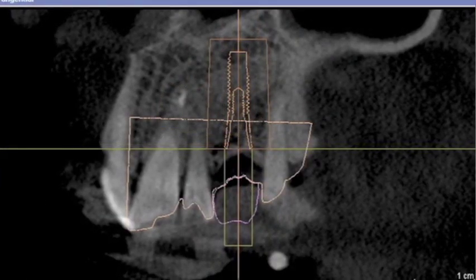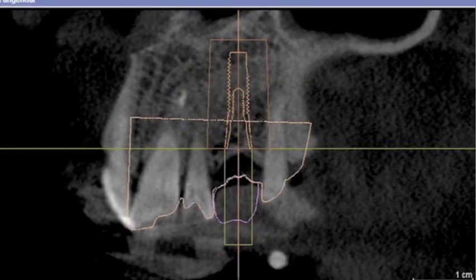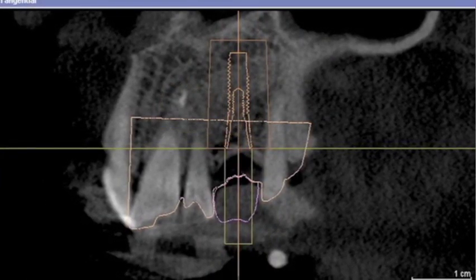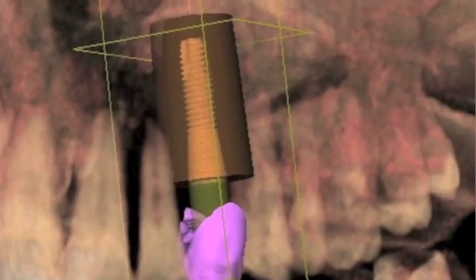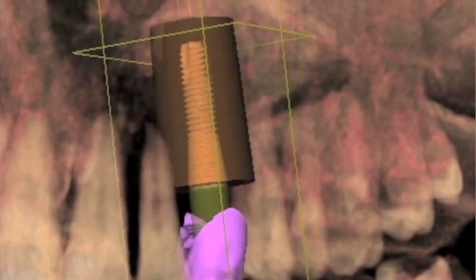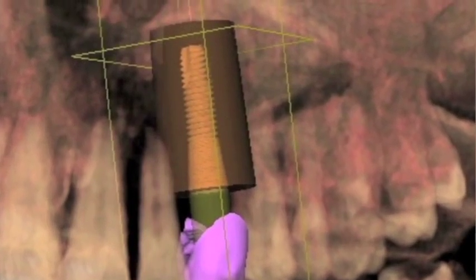With this integration, we're actually able to plan the implant placement relative to the CEREC crown — ideal surgery and ideal restoration.